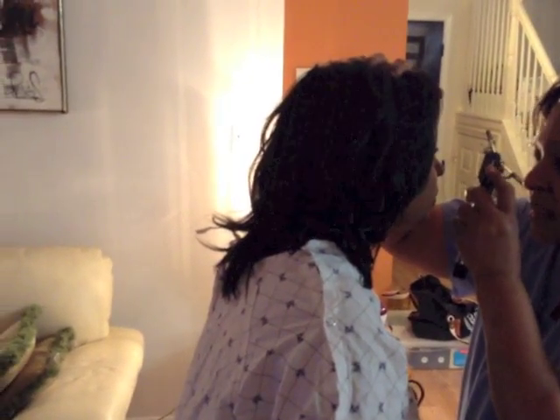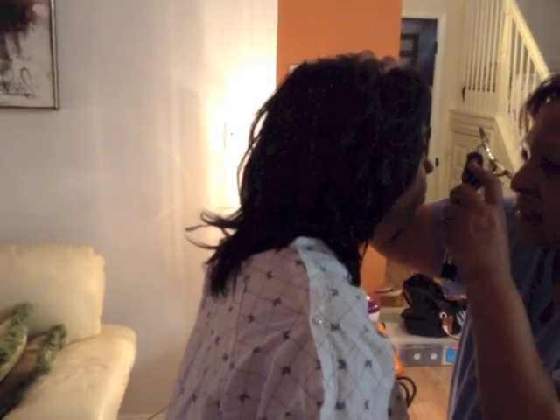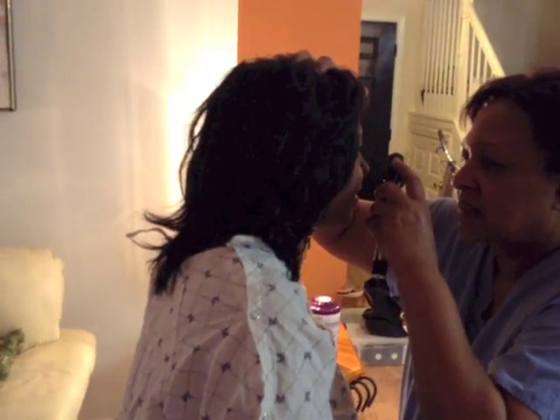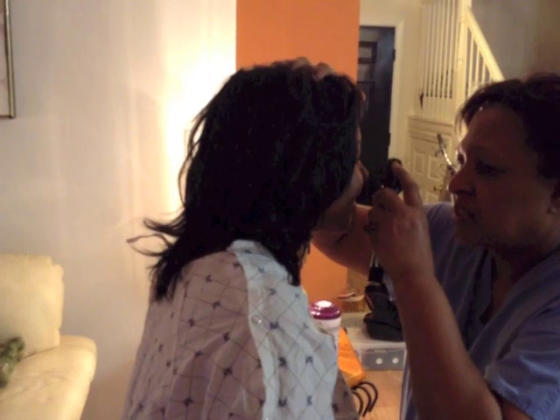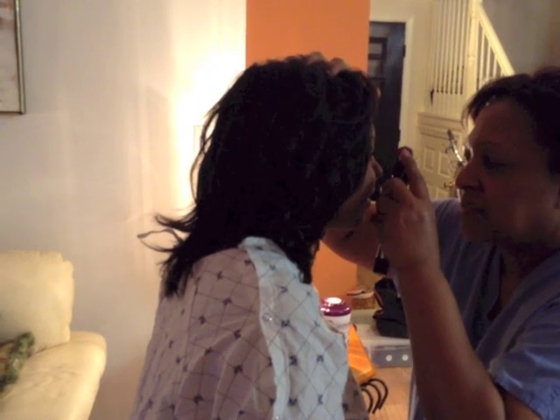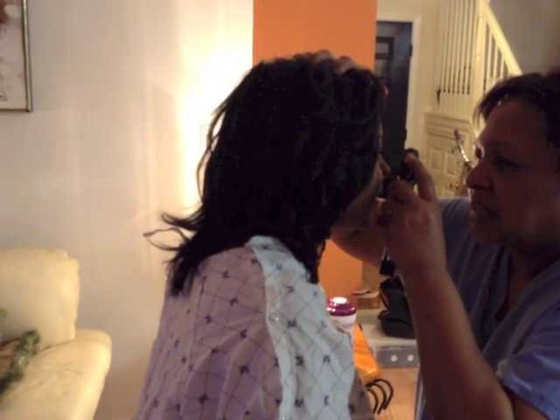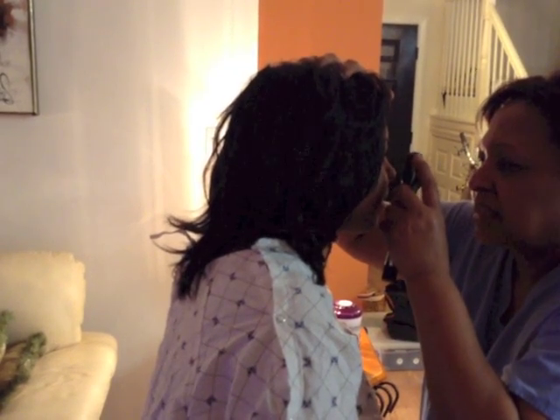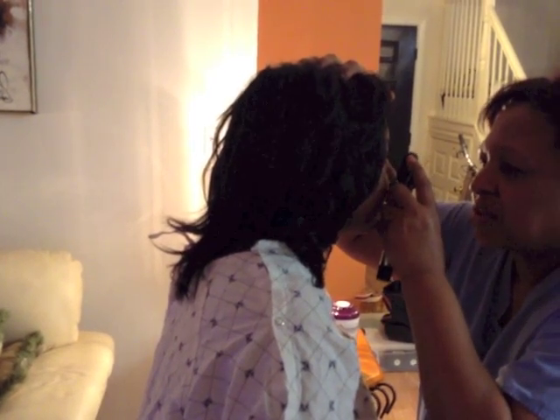Straight into your eyes. Looking into your eyes. Blink and keep still. It's all good. I see red reflection of your pupils. A light glow to your pupil. Keep staring at the red reflection. And your retina, I can see your retina in your eyes. I can see the optic nerve, which is yellowish orange.